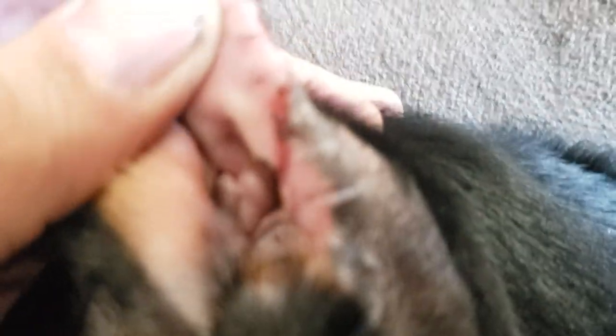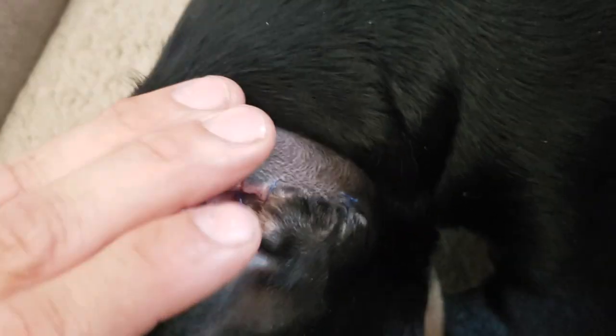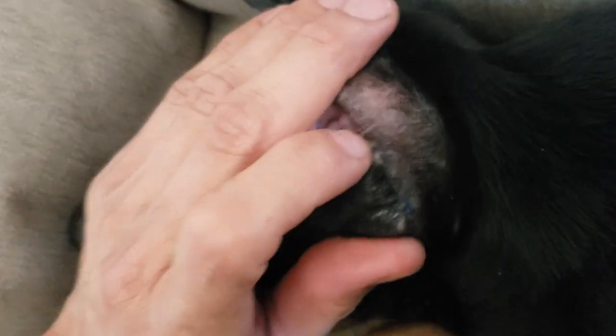It's hard — he's moving a lot. Each one, here's where it gets tricky down here. There's some healing. What you gotta do is dig your tool underneath there, grab it, pull it through. As the line gets too long, just shorten it up. We're down to the bottom. You can see this is gonna be the hard part — there's one, two, you can count the tracks. One here, one there.